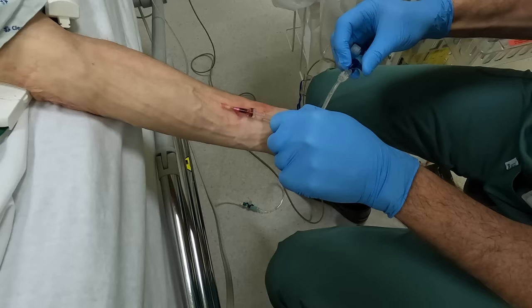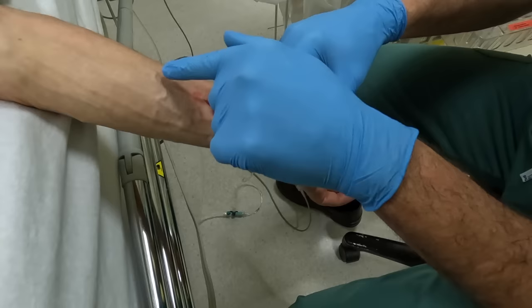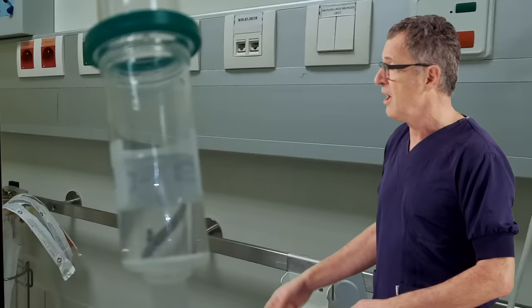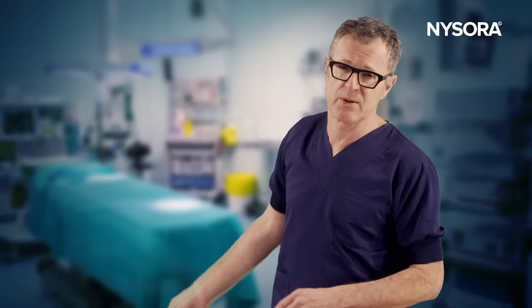And then, you can see the vein is hitting the next vein up there, but all you need to do is pull it back, and there's a flow right there. And here's the proof of the successful cannulation — a very nice IV flow.